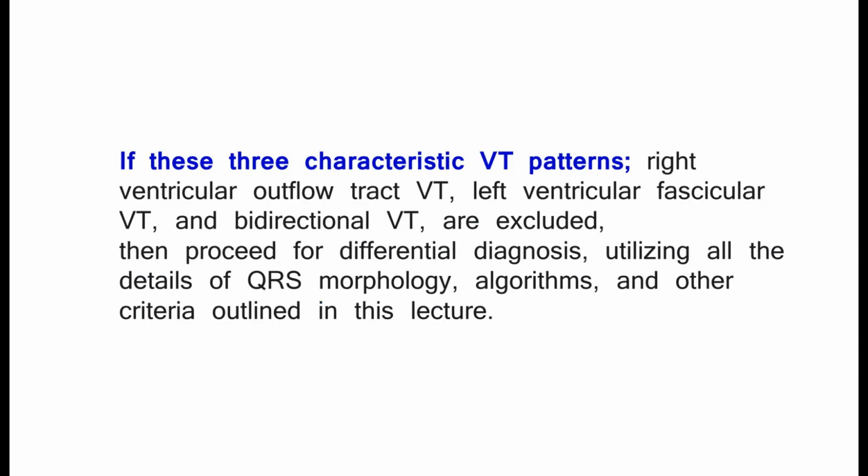If these three characteristic VT patterns, right ventricular outflow tract VT, left ventricular fascicular VT, and bidirectional VT, are excluded, then proceed for differential diagnosis, utilizing all the details of QRS morphology, algorithms, and other criteria outlined in this lecture.